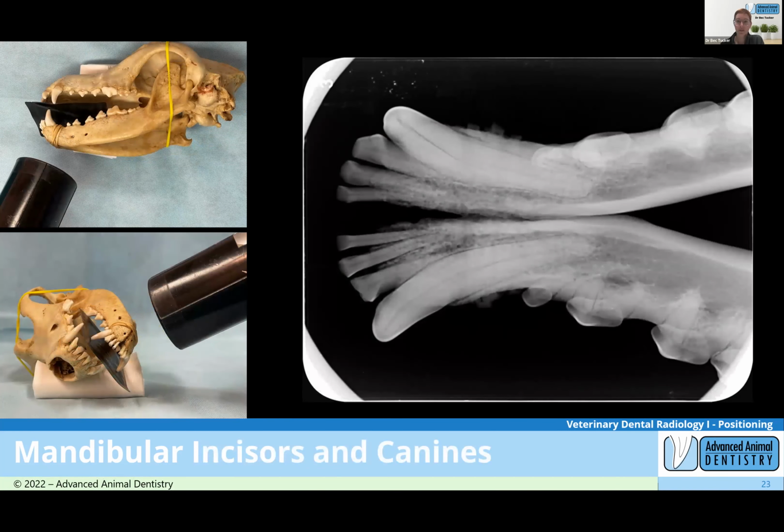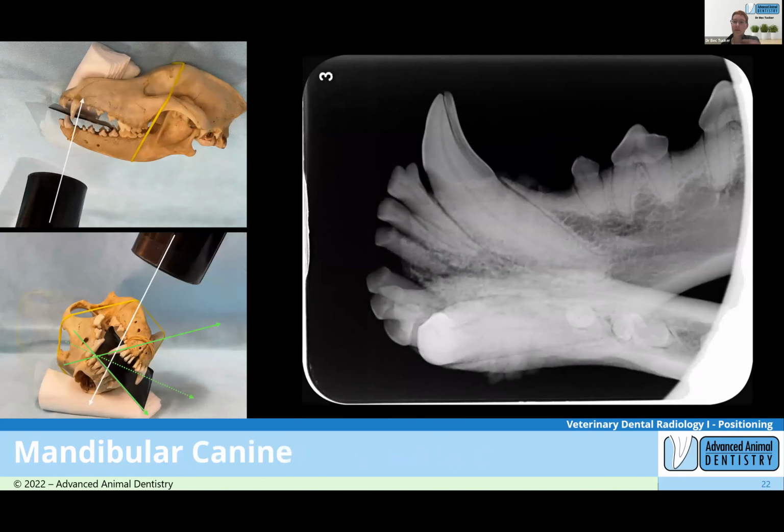So this is the more traditional straight-on rostral mandible shot. Again, we'll generally use that for survey views just to see if we've got anything going on. This previous image, when I flick back to that, I do tend to like it, and I'll generally probably take these, but if I've got a young, perfectly healthy patient and I'm not really worried about stuff, I'll settle for just that straight AP type or ventral dorsal view.